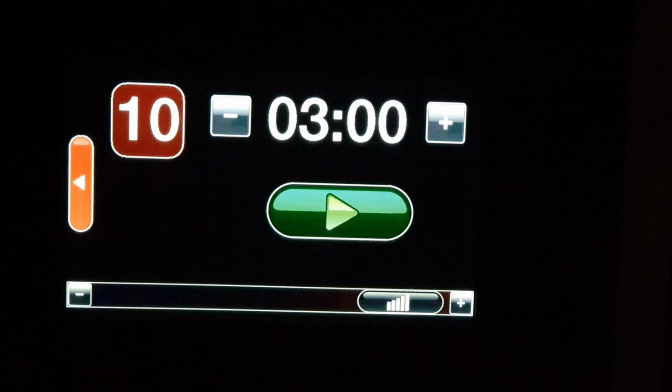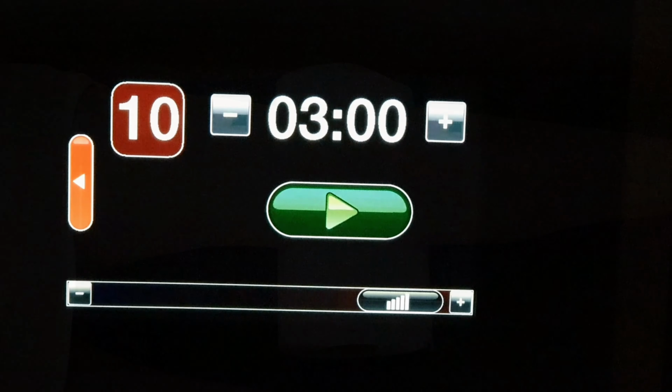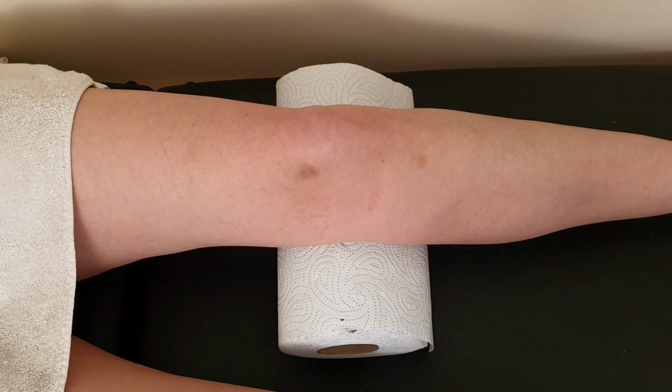You'll see it's preloaded the intensity at level 10, that's the highest level, and it's preloaded the time to about 5 minutes. I'm actually going to do 1 minute per treatment head size on the MCL, so I'm going to bring that treatment time down to 3 minutes. We'll go across now to the patient and have a look at this from the treatment perspective.